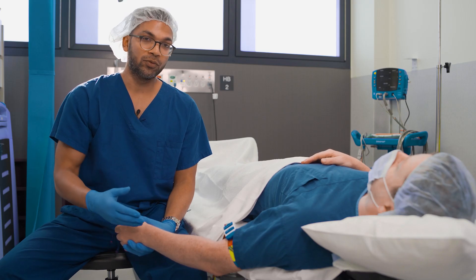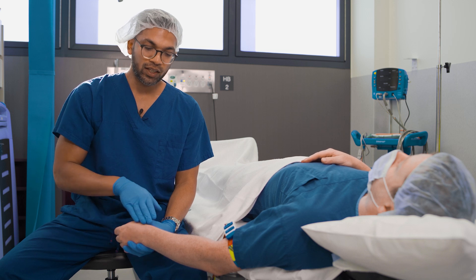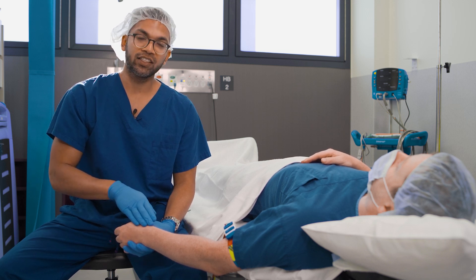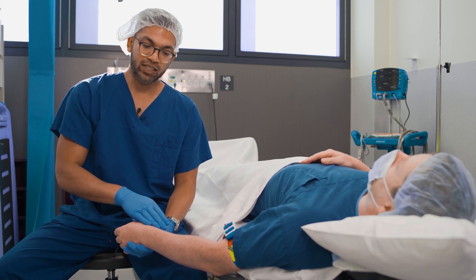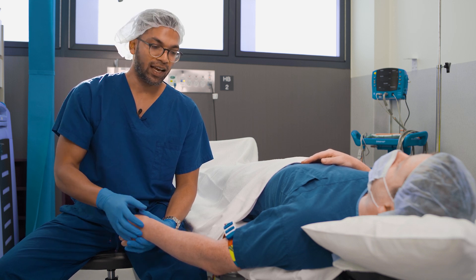The forearm is a really great site — often there are really big veins that you can put large cannulas into for resuscitation. It's also very comfortable for the patient; for example, they can still move their hand and also move the elbow without blocking the flow of any fluid or medications.